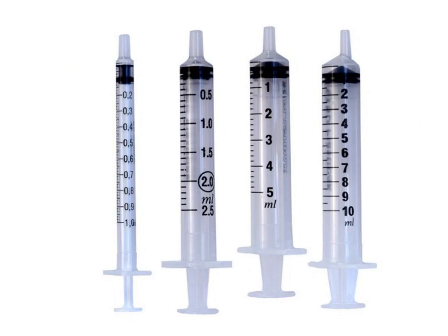In this example, we can see, like I said, a small syringe there at the front. This first syringe is only a 1 milliliter or 1 cc syringe. Meaning if I only needed to give a patient 0.4 milliliters of medication, I would more than likely use this syringe because I'd be able to draw it to the 0.4 spot. Whereas instead of using the 10 milliliter syringe over here, that goes all the way to 10 full milliliters, if I only need to give part of a complete milliliter, 0.4 would be somewhere way up here.